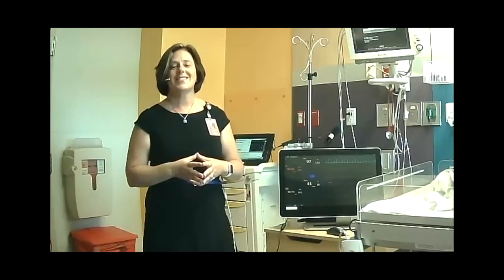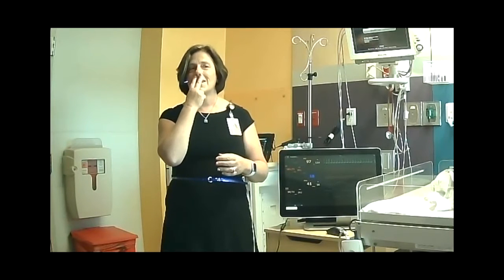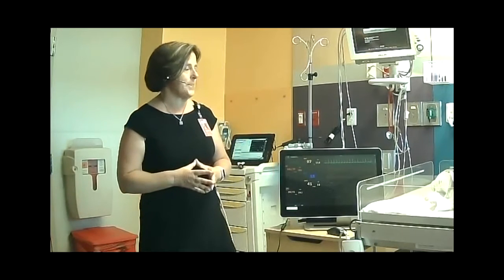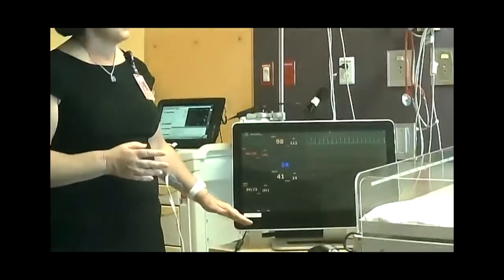You may have actually experienced it if anybody got a tooth pulled. Did you ever get a tooth pulled, all right? And they put a little nasal cannula in your nose. Because they're sedating you, they're watching your breathing through that little cannula. It's showing how much carbon dioxide, meaning if I give you too much of the drugs, you're not going to breathe as fast, and so that number would go up. So that's what we're watching for. It also shows us how the ventilator is doing. So those are the base components of the monitor.